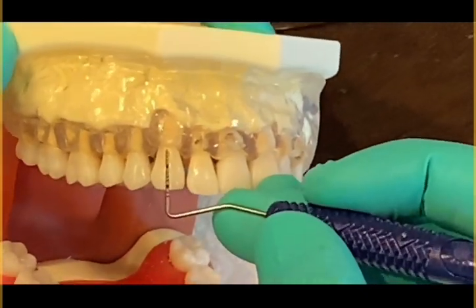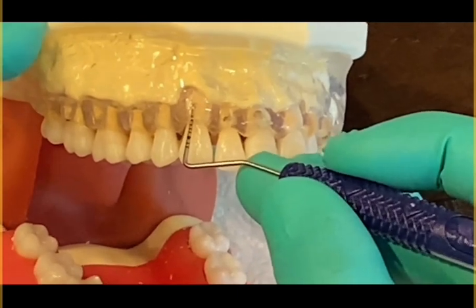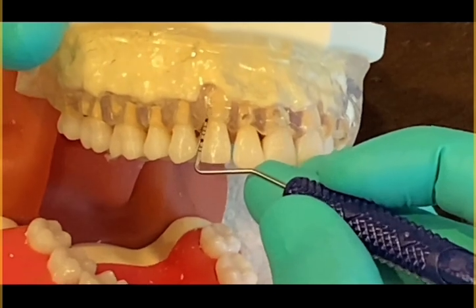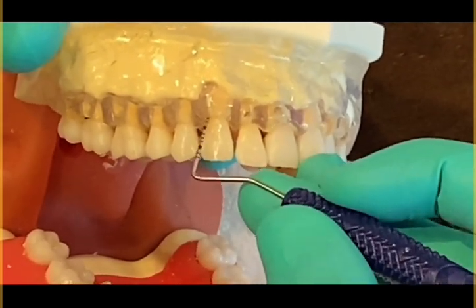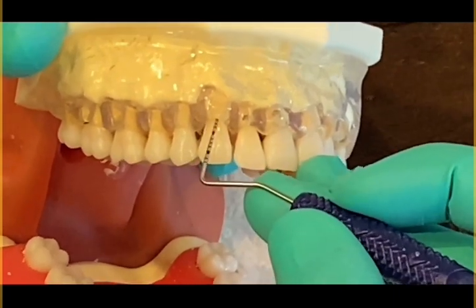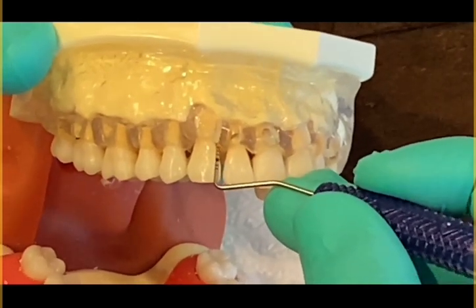On to number 6, distal line angle, pointed towards the apex of the tooth, and tilted from the tooth. Walking, that's 4 millimeters. 5 millimeters. 5 millimeters.